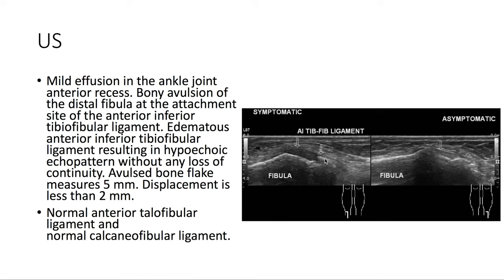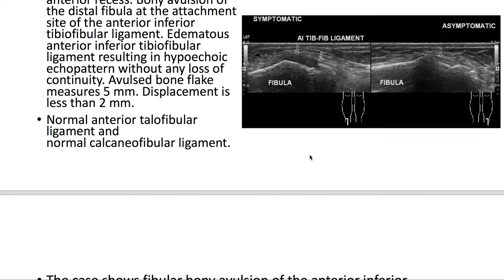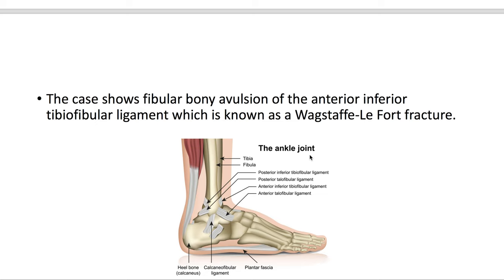On ultrasound, we note a bony avulsion of the distal fibula at the attachment site of the anterior inferior tibiofibular ligament. The avulsed bone flake measures about five millimeters and the displacement is less than two millimeters. We also note that the ligament is edematous, as evident by this hypoechoic pattern. This case shows fibular bony avulsion of the anterior inferior tibiofibular ligament, which is known as a Wagstaff-LeForte fracture.